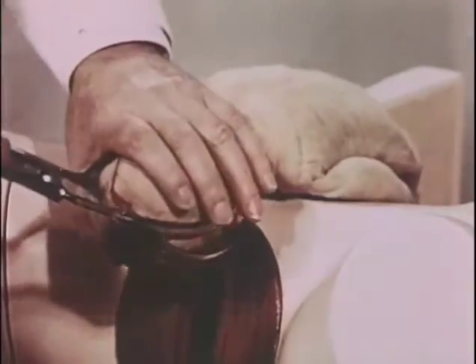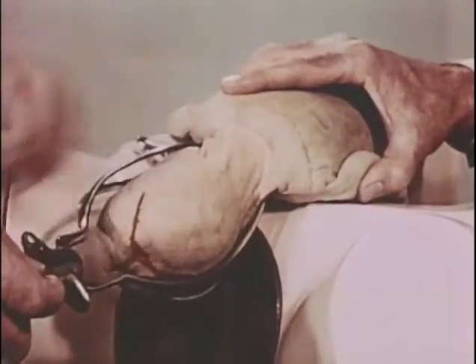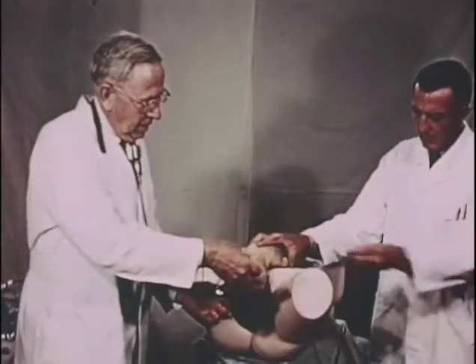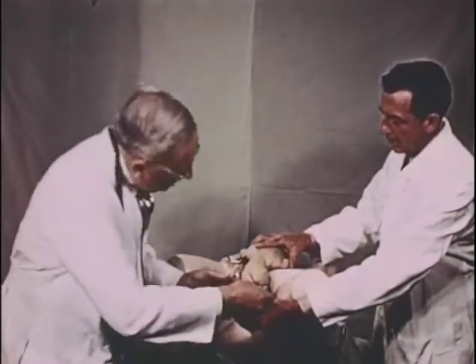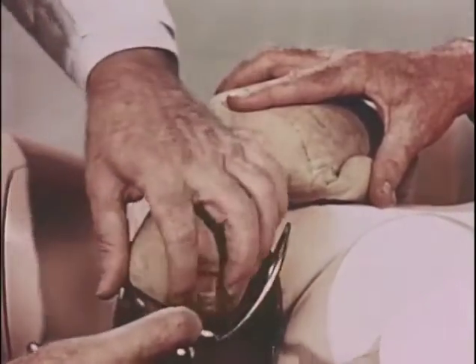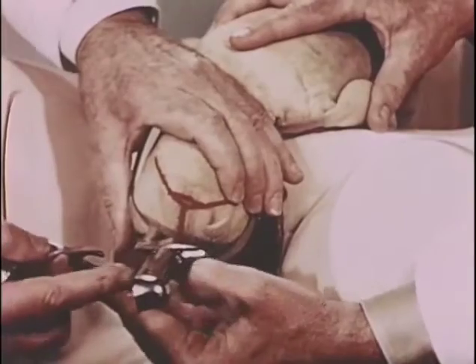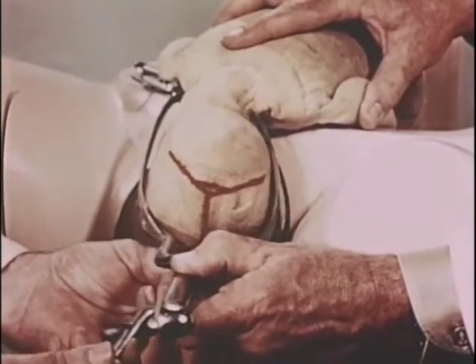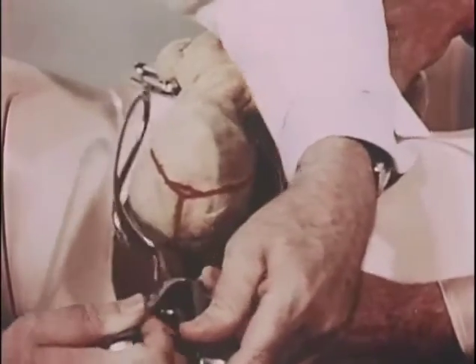Correction here is a little more difficult, but it's done by unlocking the handles, and the assistant will hold that posterior blade first, that one right below, that's good, and then the anterior blade is shifted forward so that the sagittal suture will be at right angles to the plane of the shanks. Then the assistant will hold that in place, and the posterior blade is moved forward away from the brow so it would be opposite the cheek, as it should be, and then relocked in this position.